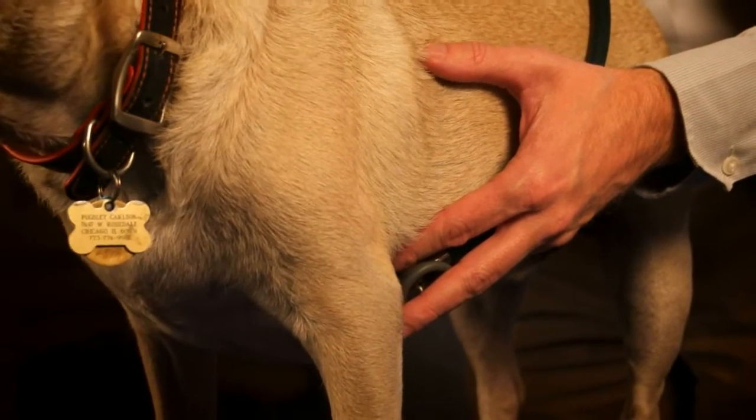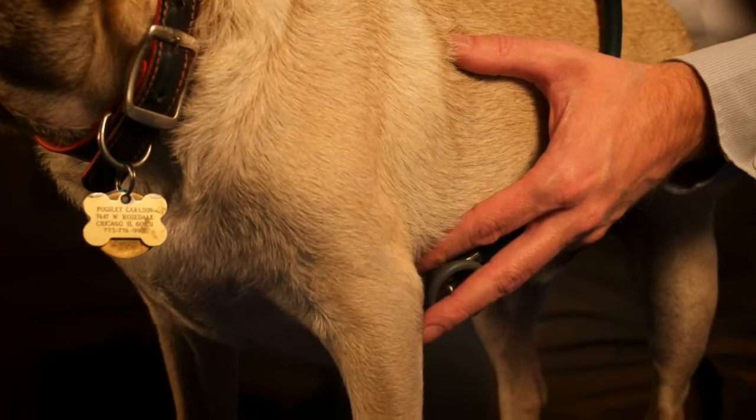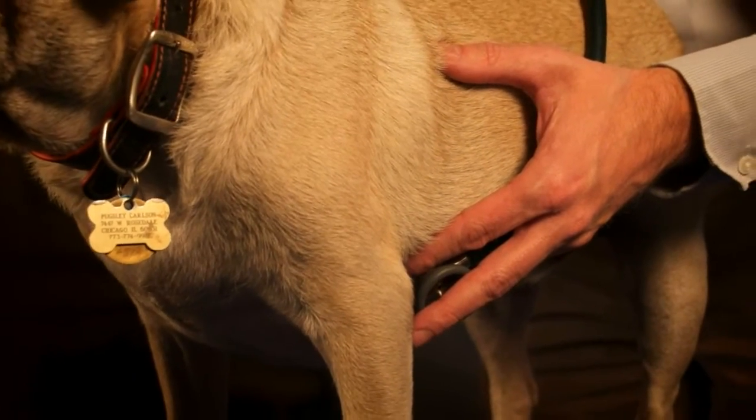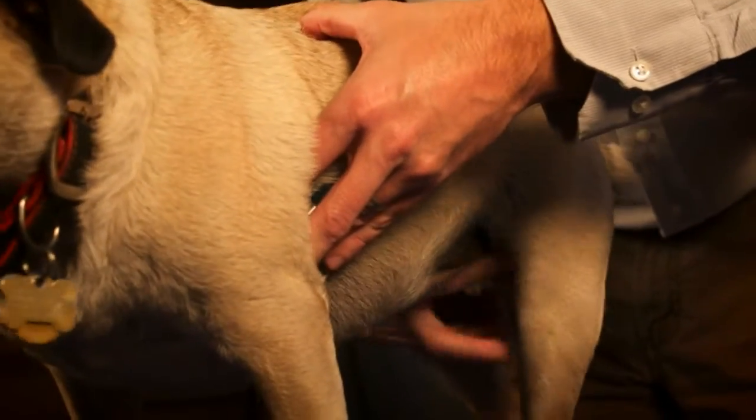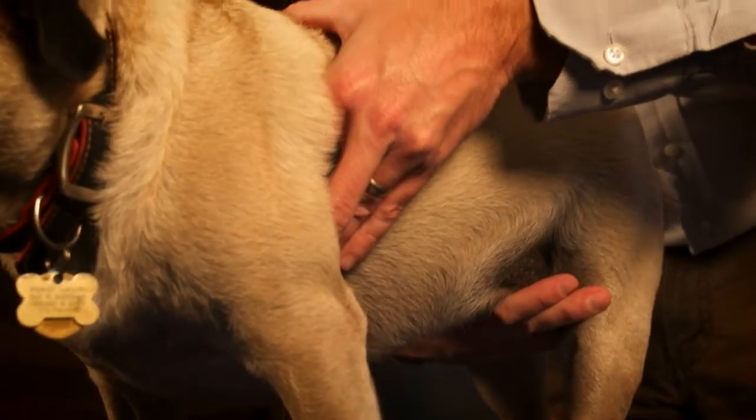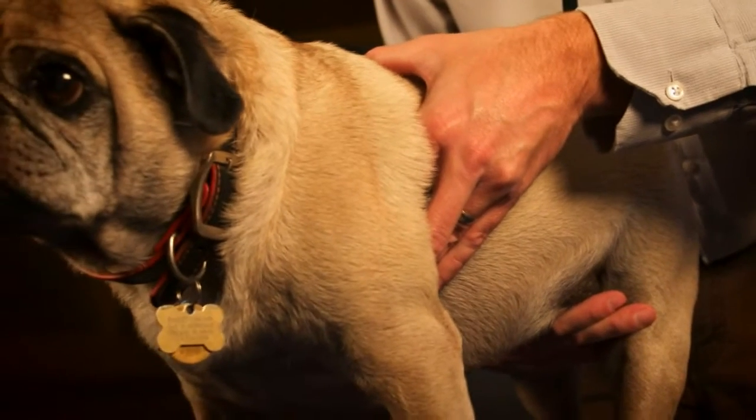We're going to detect the transient heart sounds. We're going to listen for murmurs, gallops, or arrhythmias. We're going to then move rostrally and dorsally up underneath the armpit, essentially towards the heart base as the S2 heart sound increases in intensity.